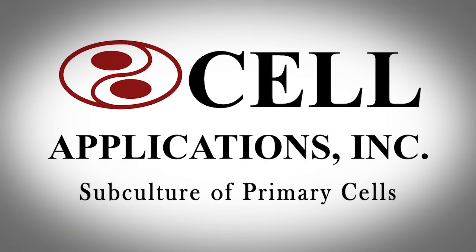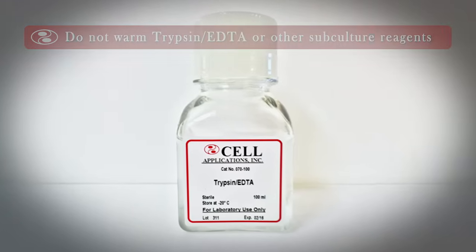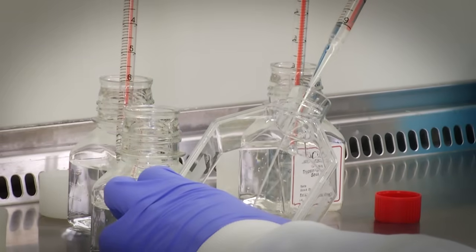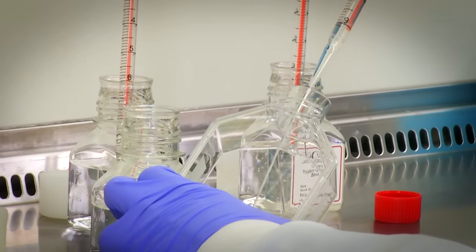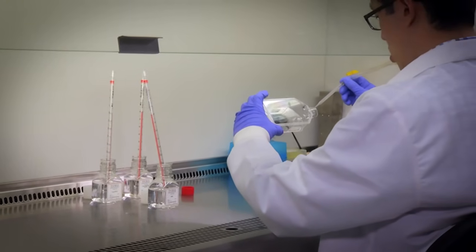Subculture of Primary Cells. Do not warm the trypsin EDTA solution or any other subculture reagents to 37 degrees Celsius. Also, be sure to use Cell Applications trypsin EDTA solution which has the correct trypsin EDTA concentration. Subculture the cells when they reach 80% confluence. Aspirate away the medium from the T75 flask. Wash the adherent cells with HBSS and remove by aspiration. Pipet 5 ml of trypsin EDTA solution into the T75 flask and rock gently to ensure the solution covers all the cells. Aspirate 4.5 ml of the trypsin EDTA solution immediately.